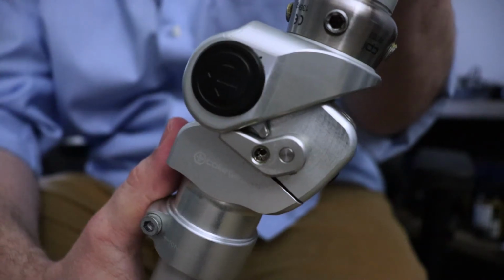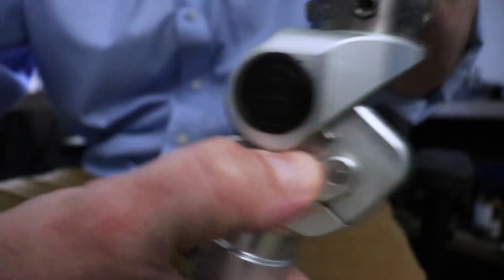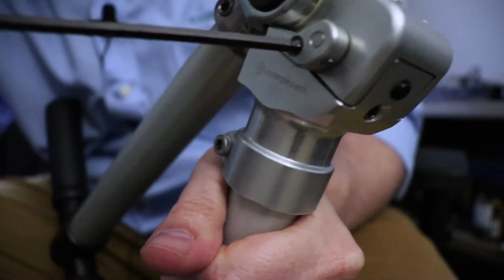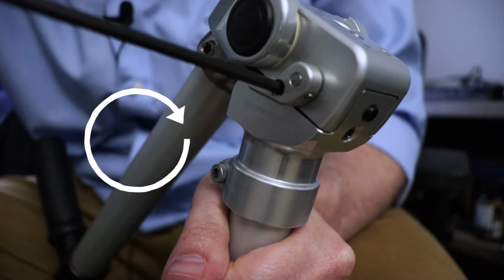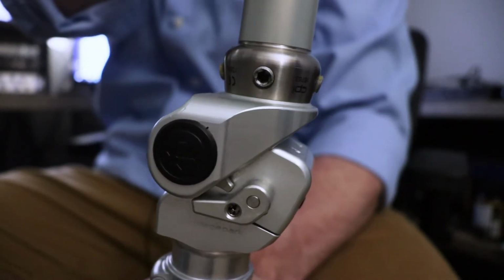Now to exit locking mode or turn it off, I'm going to unlock the knee here and flex it completely. And then I'll just do the opposite of what I did before. I'm going to turn this fastener to the right until it stops. It should feel some resistance there and stop. And now you're back in the weight activated mode, friction brake mode. See, it's not locking now.